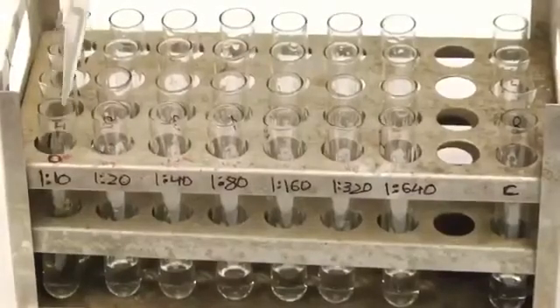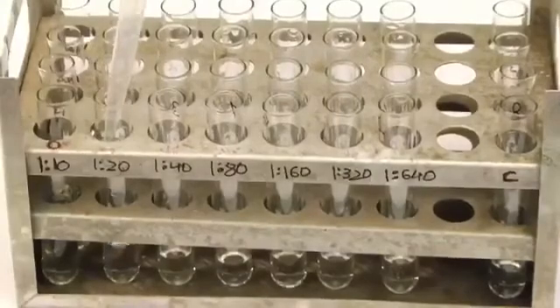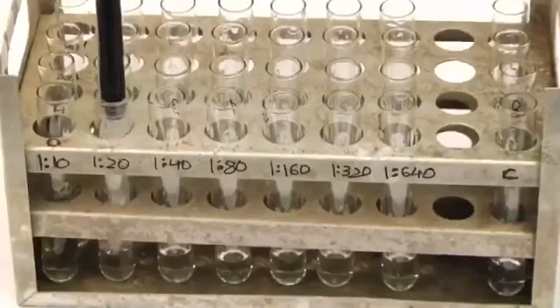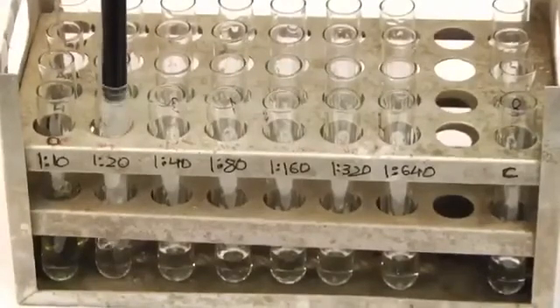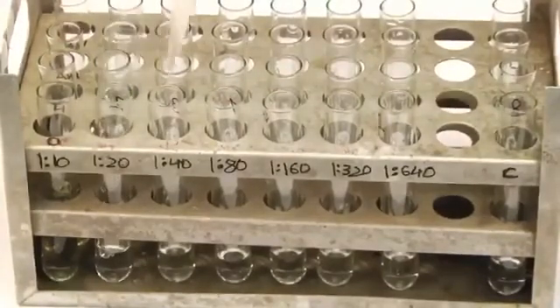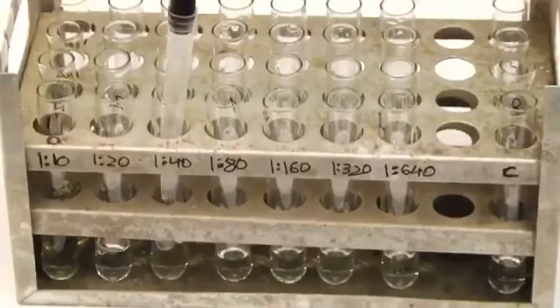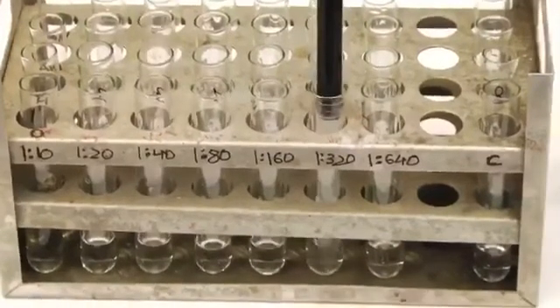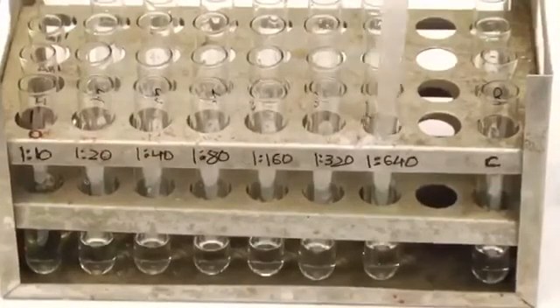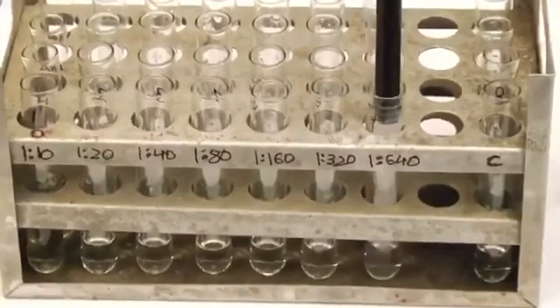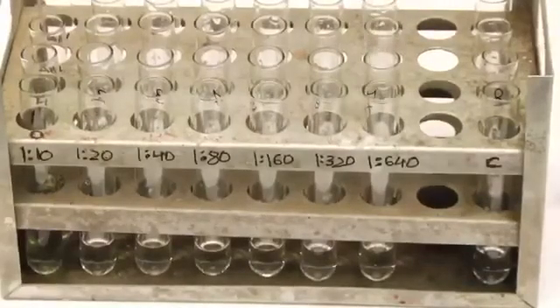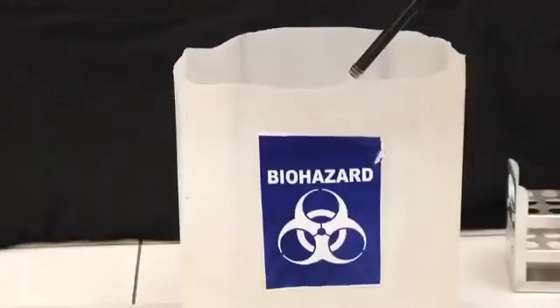Transfer 1 ml of the diluted serum sample from tube number 1 to tube number 2 and mix well. Transfer 1 ml of the dilute serum sample from tube number 2 to tube number 3 and mix well. Continue the serial dilution till tube number 7 in each set. Discard 1 ml of the diluted serum from tube number 7 of each set.